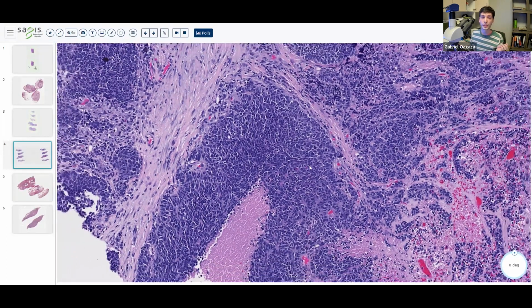A very boards relevant tidbit is that the CK20 is perinuclear dot-like in its appearance. And perinuclear dot-like, I'm not aware of that being used as a descriptor for pretty much anything else in dermatopathology. So it's basically the point where if someone says the words perinuclear dot-like to me, I'm like, oh, you're thinking Merkel. Like it's just a one-to-one association, and you're talking about a CK20. So that would be the case here.